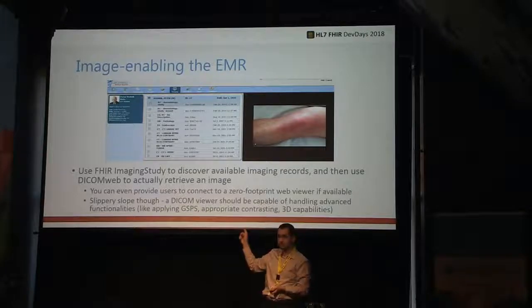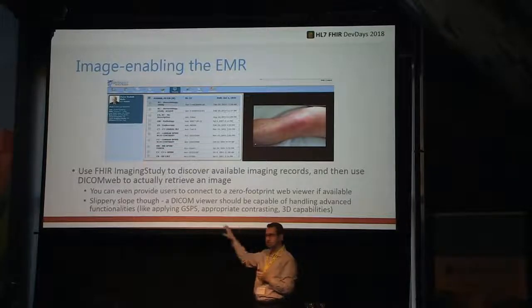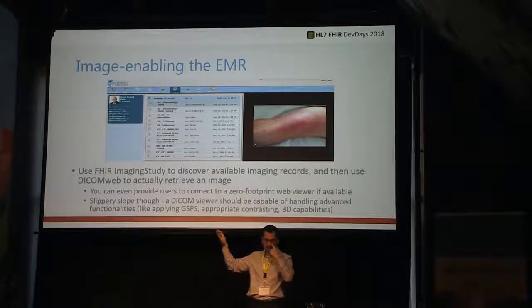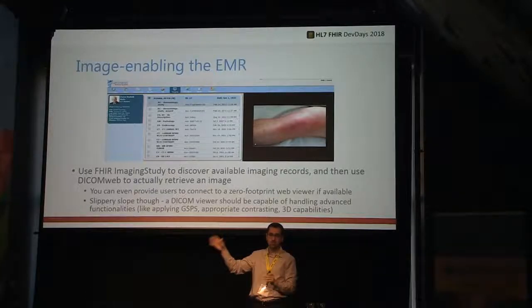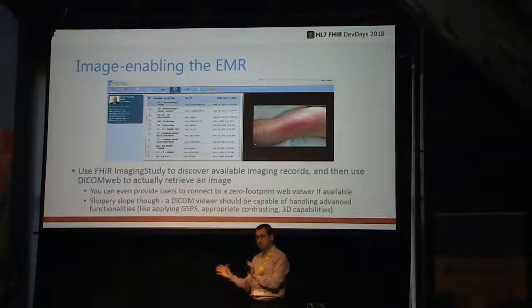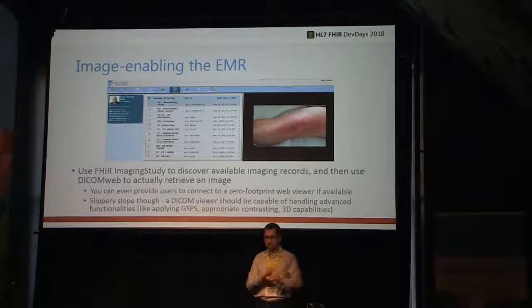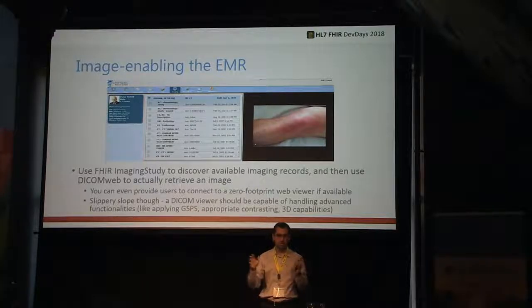And again, the example here shows you an image that would have been captured with a normal camera, which is a good example of a real life scenario, but of course also not necessarily representative. Because the other thing is, one of the questions people ask of DICOM, again, why couldn't it just be stored in JPEG? Well, because those images that are captured in DICOM may not always be 8-bit images, like every other camera device, like your phone and whatnot.